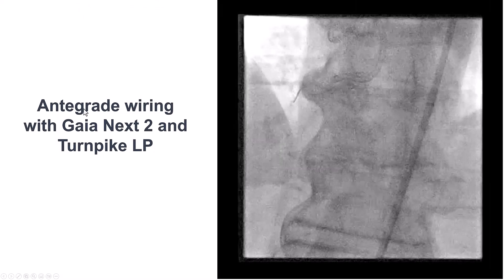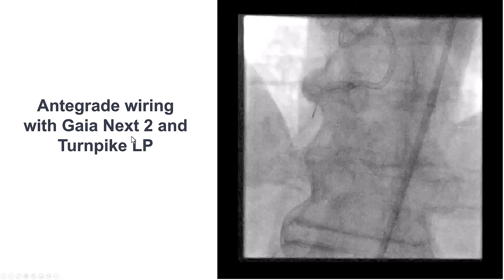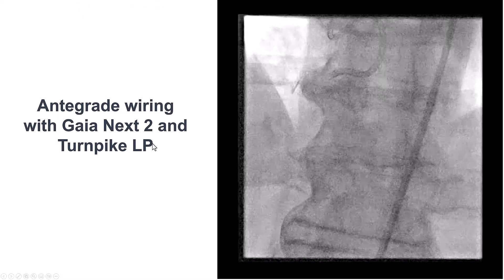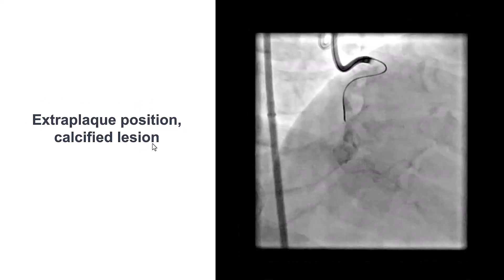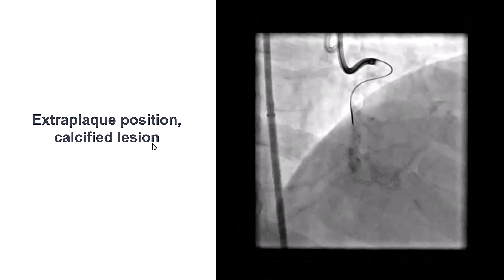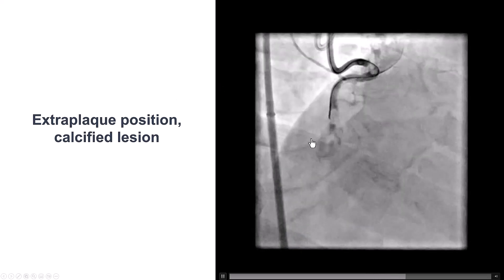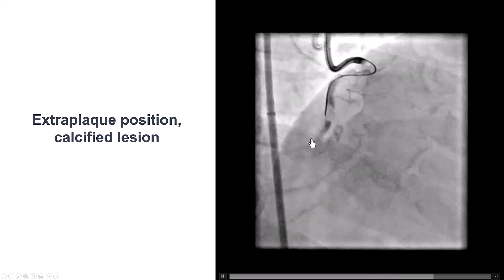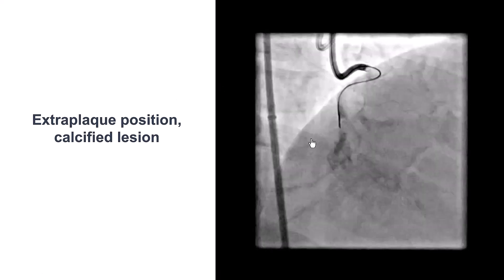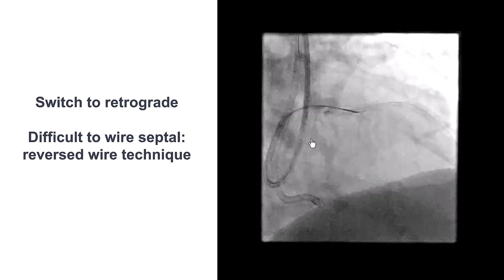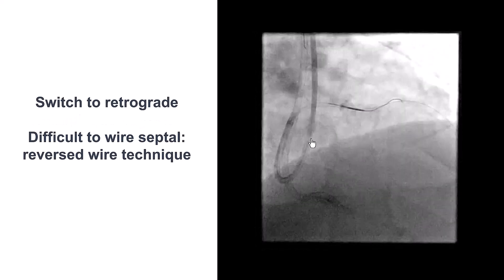We tried with a Gaia-next-2 wire and Turnpike LP microcatheter and made some progress, but the wire was actually in the extraplaque location. We tried different guidewires but had difficulty penetrating, so we decided to switch to the retrograde approach.